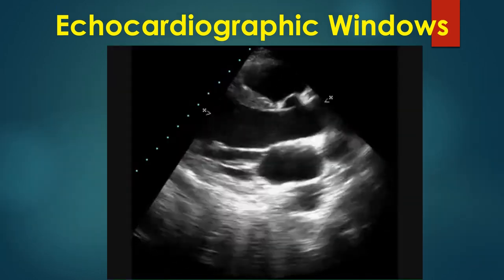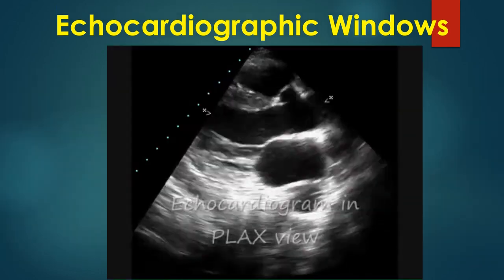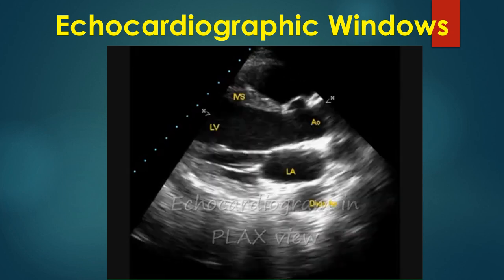An annotated video of normal color Doppler echocardiogram illustrating various views and an M-mode tracing is shown here. Keep watching.